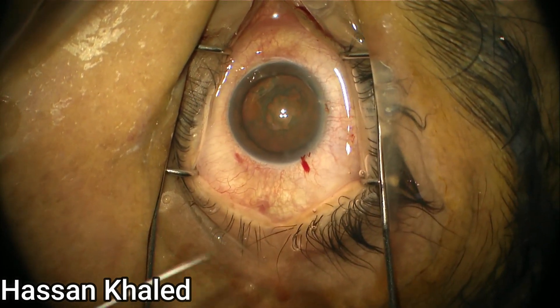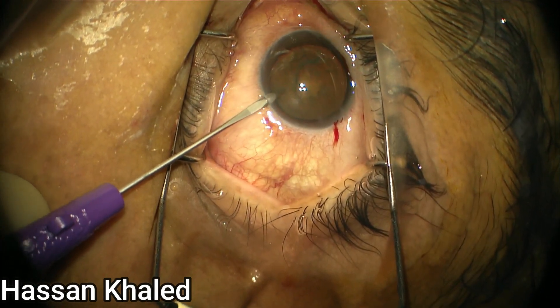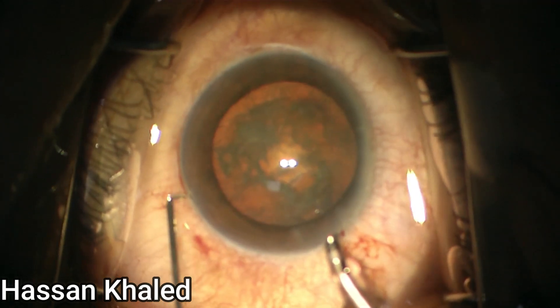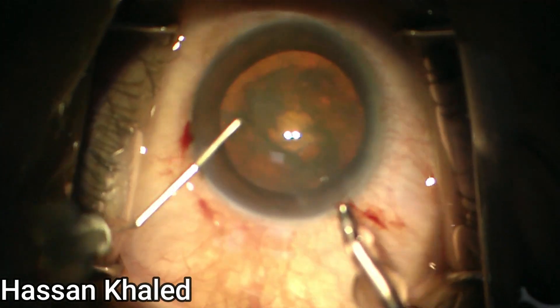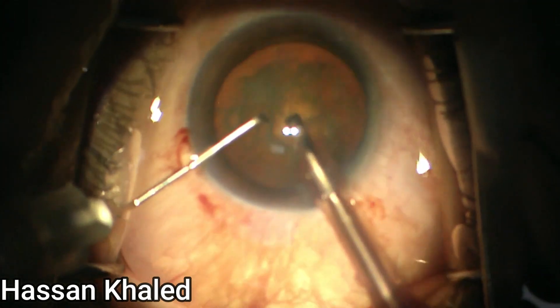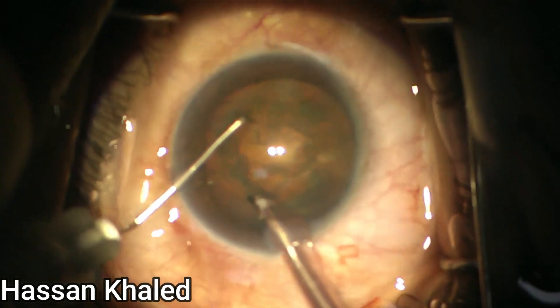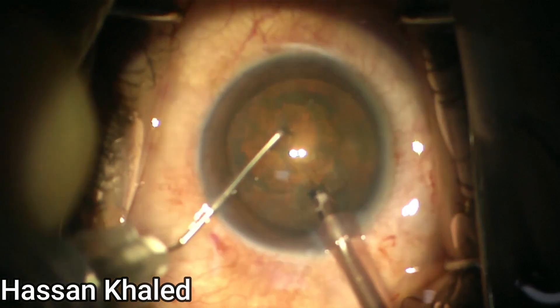Now make two side ports which are perpendicular to the main phaco incision. Here, introducing the vertical chopper through the paracentesis and introducing the phaco probe into the anterior chamber. Just do shaving for the cortical matter and the epinucleus.